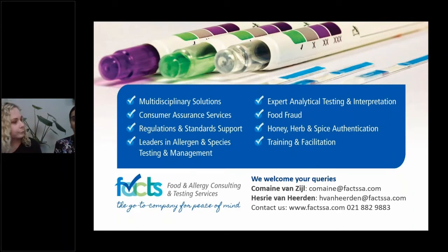And just to add to that, once you've identified what proteins you have, so if it's whey or casein, it is important to look at your process to see if the processing is also altering those proteins. Because certain kits say that it can't be used for highly processed samples, so if it's used for fermentation, you need to look at how the allergenic proteins will change during the processing steps, and will the kit then still be suitable to detect it?